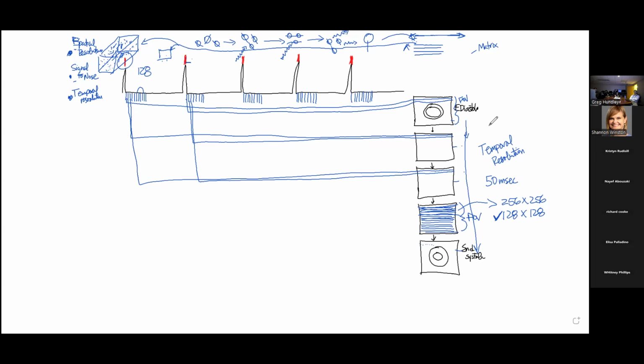I just explained this is a relatively low spatial resolution, right? Some of the images that we acquire are at a much higher resolution, and we can even go 512 by 512. We run into trouble with signal to noise, but a lot of the pictures that you're using out there have matrix sizes of 256. So how in the world did we go from 128 heartbeats taking 2 minutes at a heart rate of 60 beats per minute to 10 seconds?